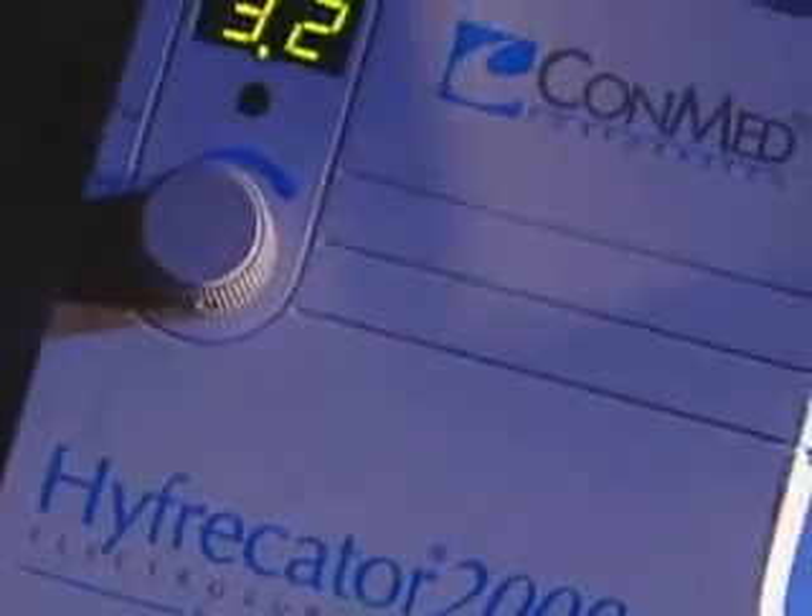There is only one Hyfrecator — the ConMed Hyfrecator 2000. Accept no imitations. Congratulations! By purchasing the ConMed Hyfrecator 2000, you've settled for nothing but the best. You've made the right decision.